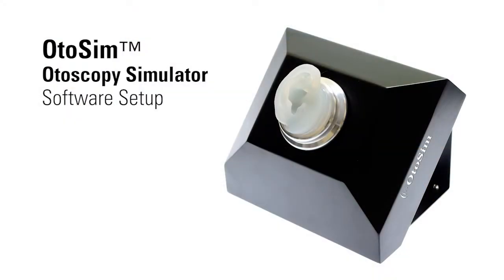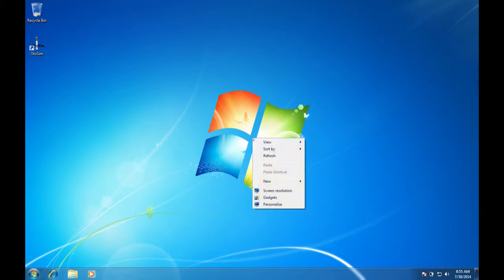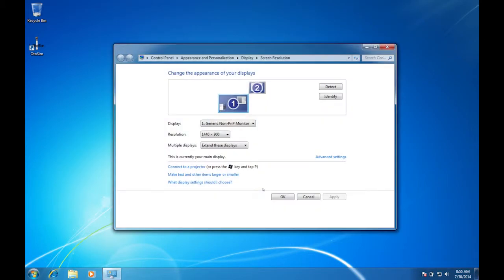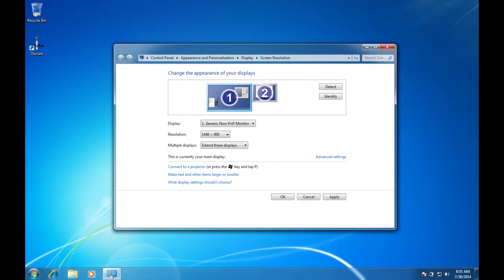You are now ready for the initial computer setup. You will only need to complete the computer setup once. Once the unit is connected to the computer, access the display preferences of the computer. The location of the display preferences will slightly vary depending on the type and operating system of the computer you are using. Please refer to the product manual for specific details. We are using a Windows 7 PC in this video. From the display preferences, please make sure that the small blue window, which represents the OdoSIM display unit, is placed at the top right corner of the large window, which represents your computer, with the top boundaries of both windows horizontally aligned.